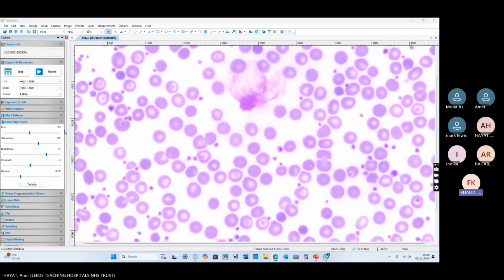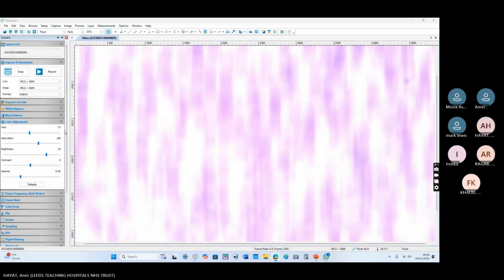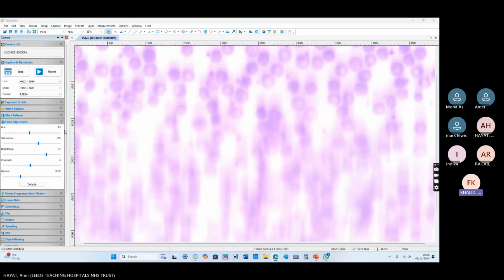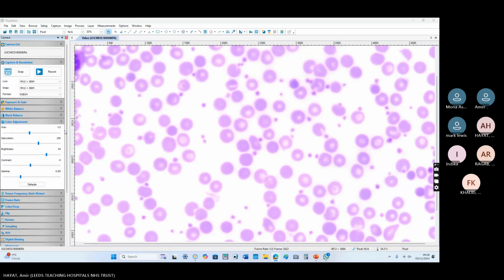But yes, the spherocytes do not fit the profile. Other than that, it is just marked thrombocytosis in a patient with viral infection. Not something that I would be interested in. Can spherocytes appear with bleeding? Yes, they definitely can. But this patient, the history you're giving is of a viral infection, isn't it? Yeah, so you need to make a proper report in which you mention the findings, and give some suggestions to them on what to do next.